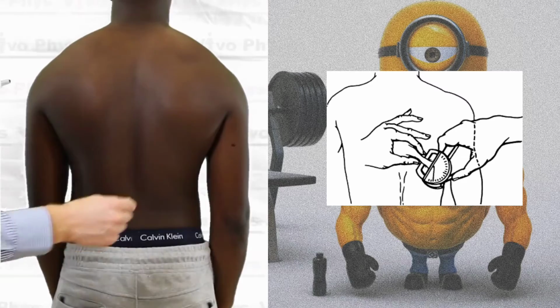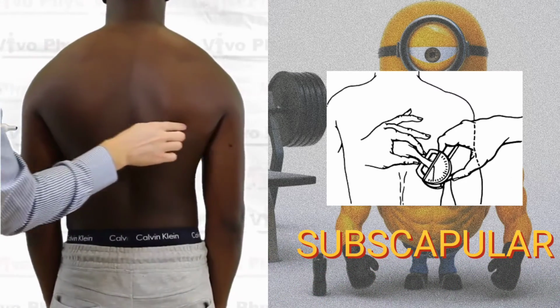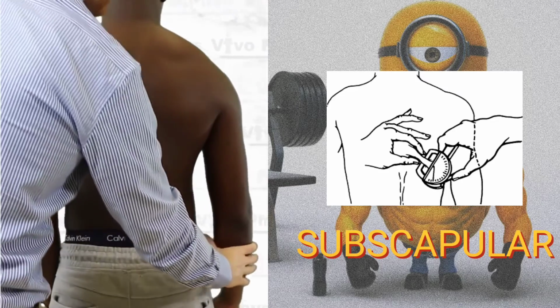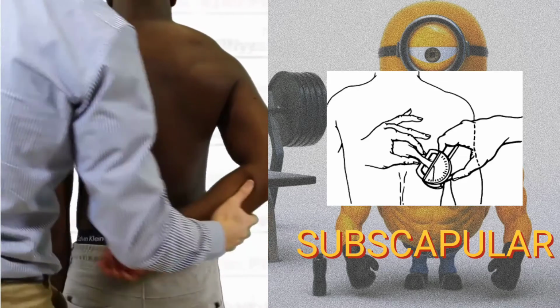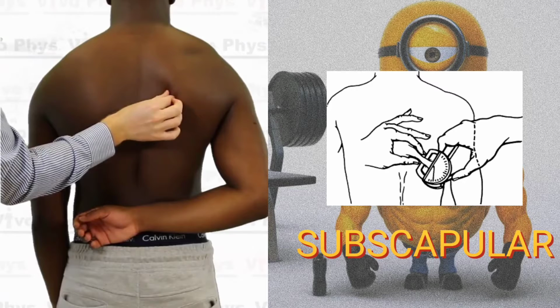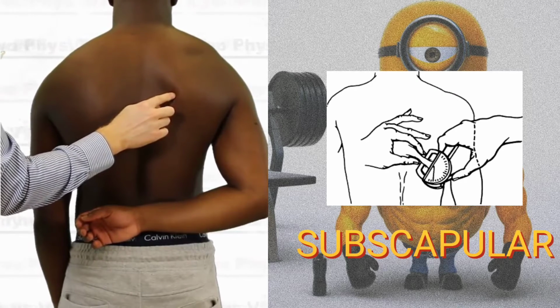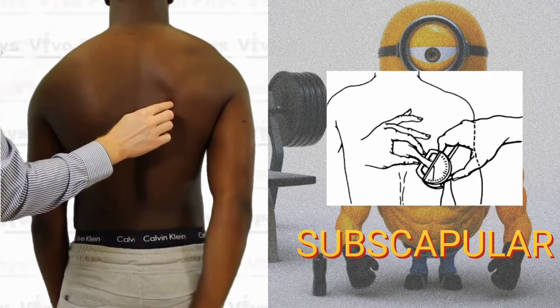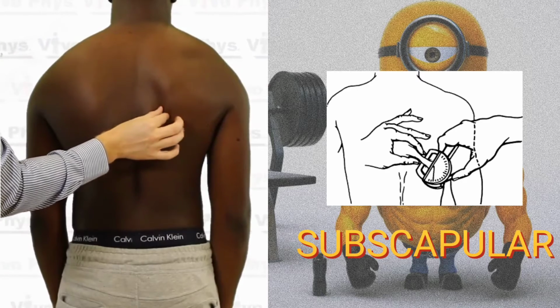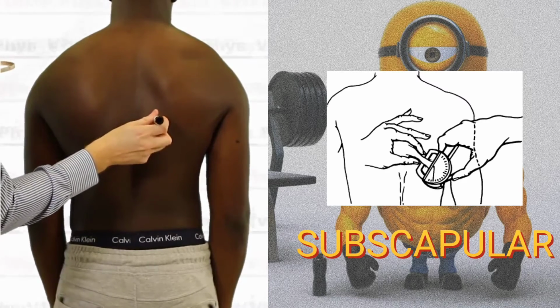In order to do the subscapular skinfold site, you're going to go to the back of the individual and look at the right side of their back. You're looking for the point of the scapula where the medial border near the spine and the inferior border of the scapula intersect, right here. If you're having difficulty feeling that border, have the person take the right arm and put it back behind their back like this, and that's going to force the scapula to go out towards you, so you should be able to feel it much more readily.